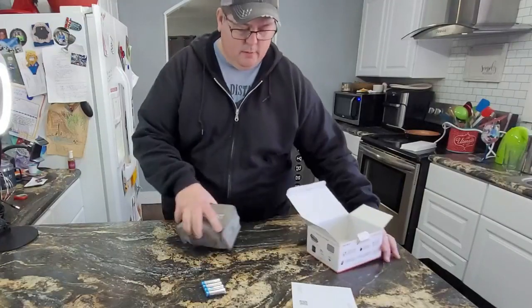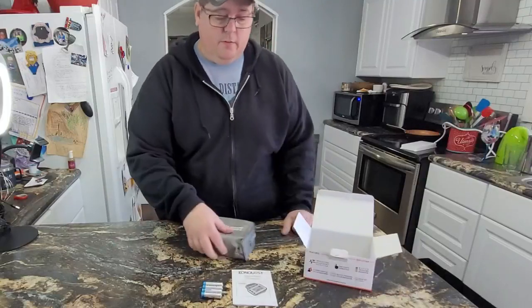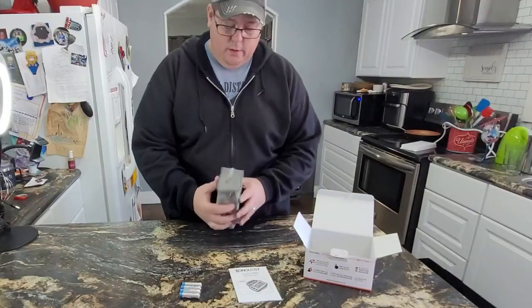And it comes with a really nice little case. It comes with your instructions — you're probably going to need these instructions to figure out how to use it and what all the different things are.